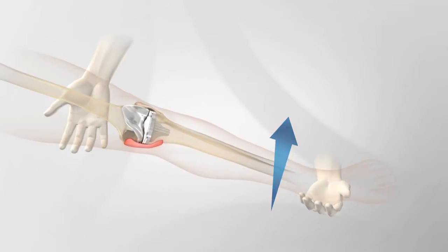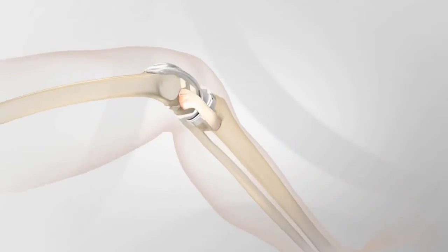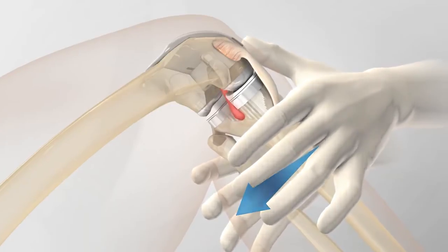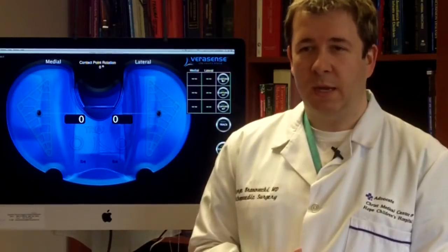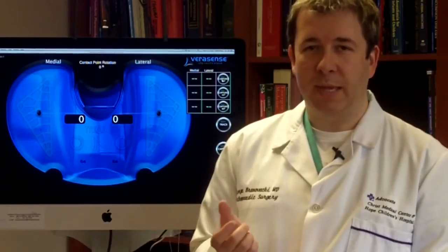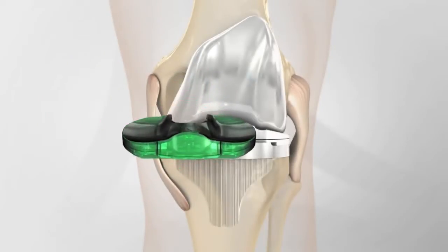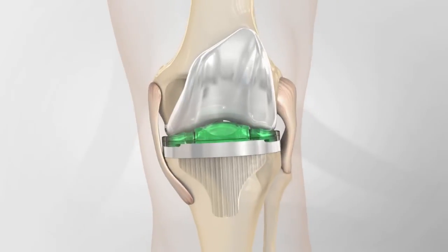Sometimes patients end up with a stiff knee. You thought you put it in properly. Sometimes they end up with a loose knee. Now, through the technology offered by a company called Orthosensor, there's a device called Verasense, which is a polyethylene type insert which has microchips in it, which we put into the knee during the replacement testing part of the surgery.